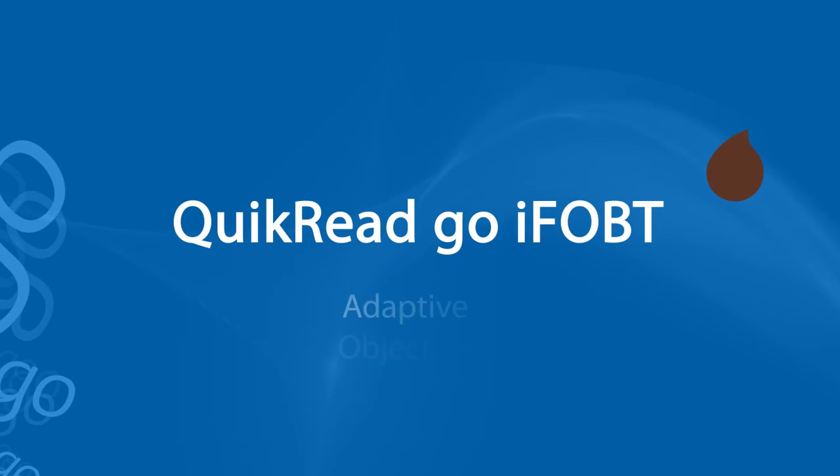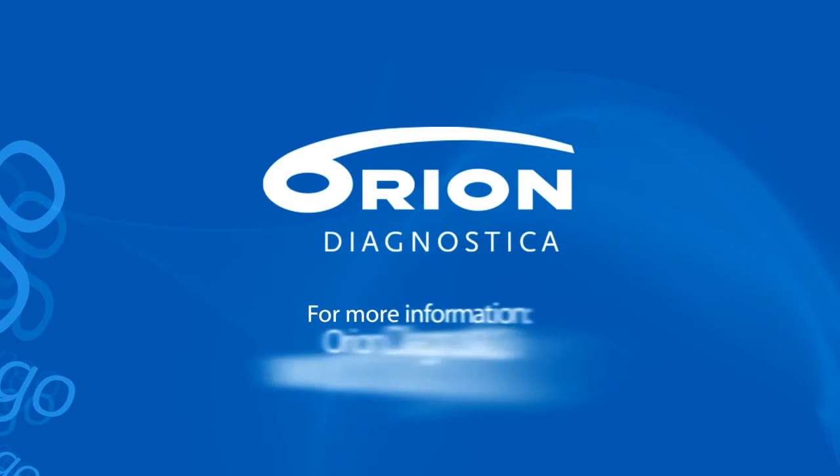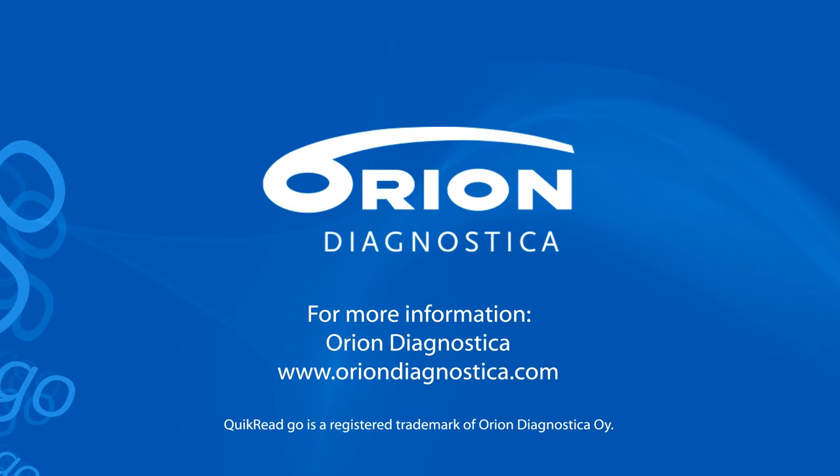QuikRead Go iFOBT — the test which allows you to customise the results display, qualitative or quantitative, gives you an objective measurement reading you can rely on. For more information, please contact Orion Diagnostica.